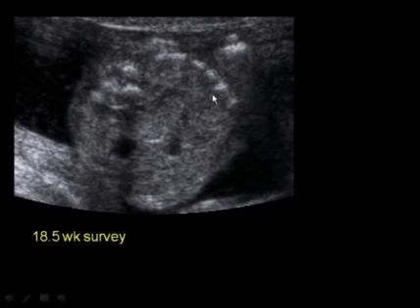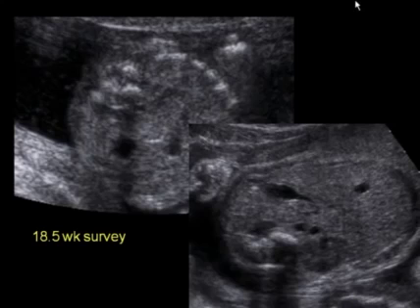Here's a patient who was seen at 18.5 weeks with normal kidneys reported, and this is the image that came out labeled kidneys. And here's the stomach here, and we can see a probable kidney on the right here, but there's nothing convincing on the left. There's a little hypoechoic structure here, but this is too high to be in the region where a left kidney should be, because we have the stomach right there. And indeed, when this patient returned at 30 weeks, again, here's the right kidney, aorta, IVC, stomach bubble, and a little hypoechoic area here, but no definite kidney seen in the left renal fossa.